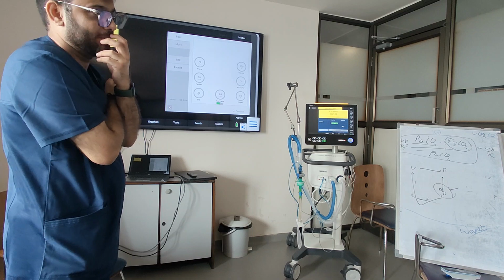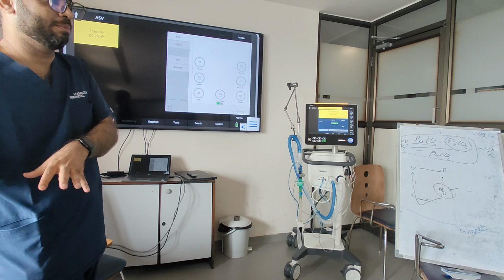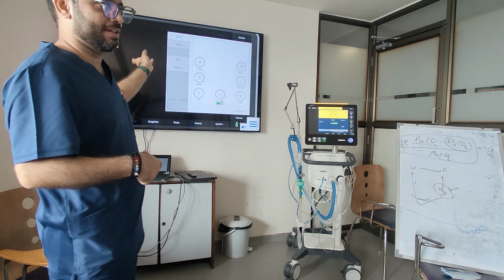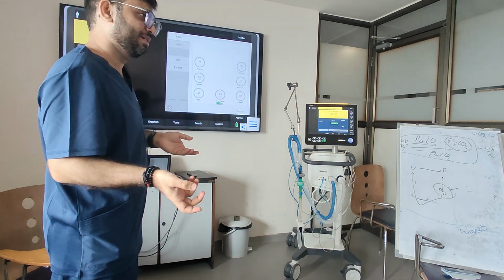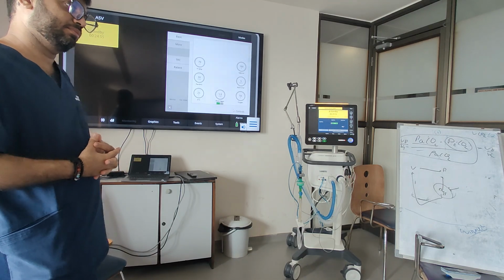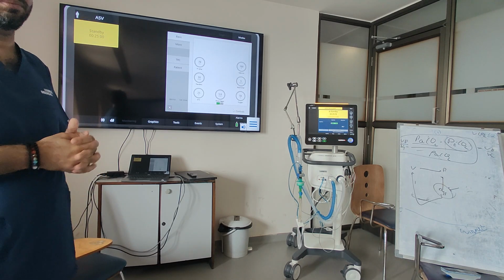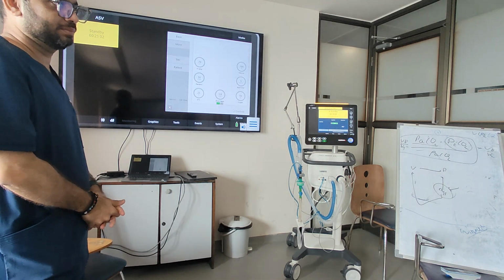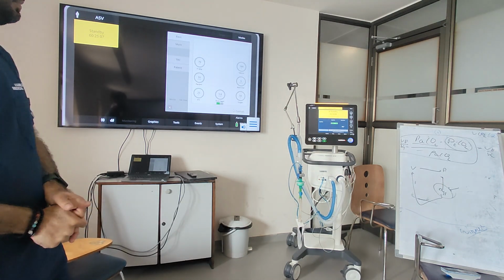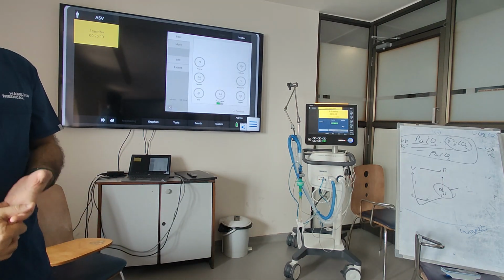Then move to ASV. But then you have a patient who is in an emergency, you have sedated the patient, like with a code blue and all. And then when you initiate the ventilation and you start with, say, ASV, because the patient is sedated and paralyzed. If you are completely paralyzed, no. If you are completely passive, then it's okay. But nowadays we don't paralyze so much. We paralyze once and then we forget. Then when do we paralyze again? Unless we are doing our TPP measurement, we otherwise don't paralyze. So that is the issue. But maybe we might be a unit which will start doing it early. Let us see. We don't know.